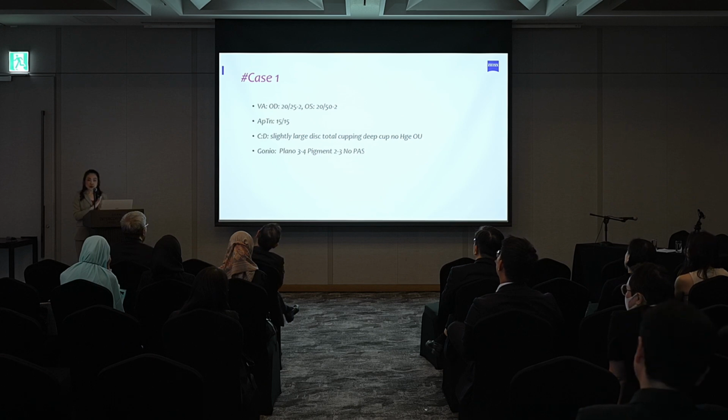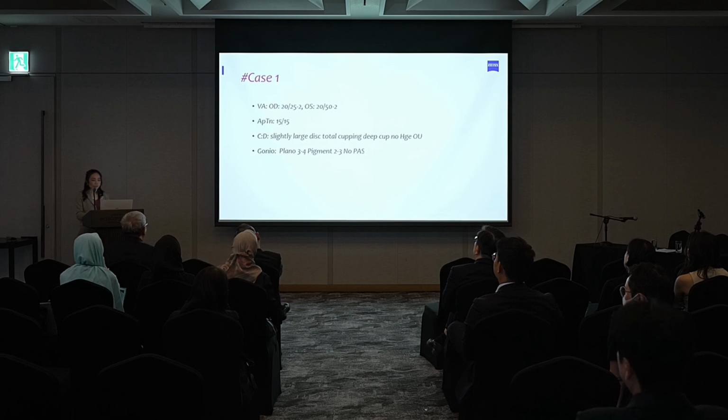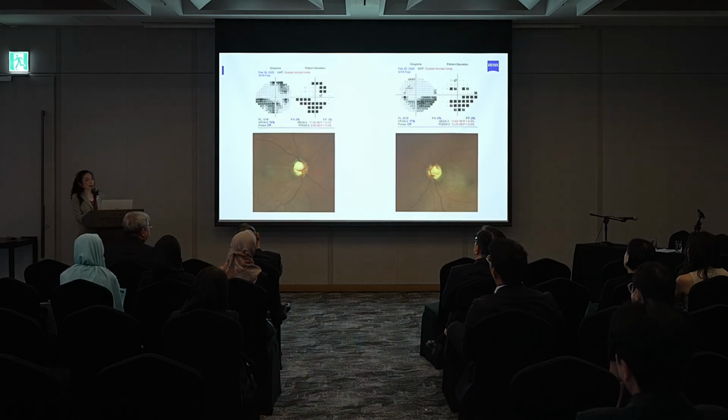His vision is pretty good. In the left eye it is slightly worse. The tension is 15 in both. The cup-disc ratio is like this. So it is definitely glaucoma.